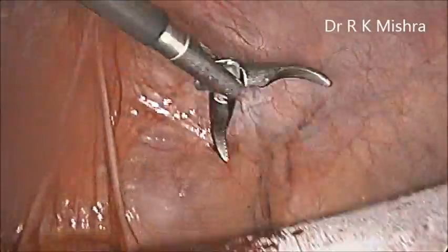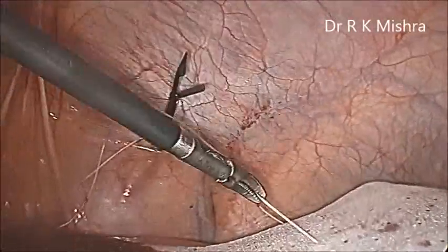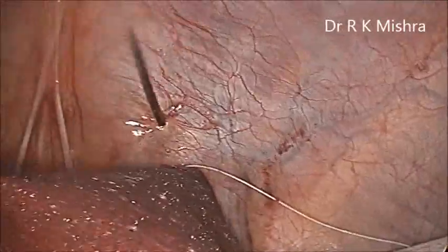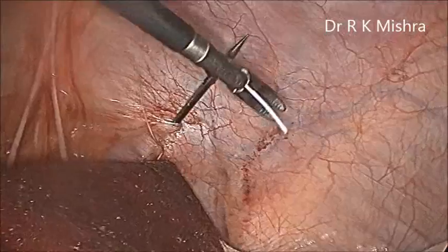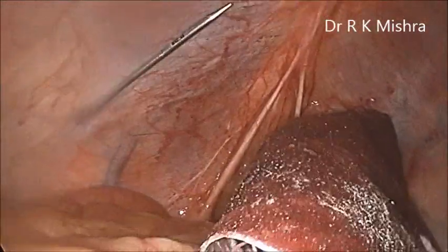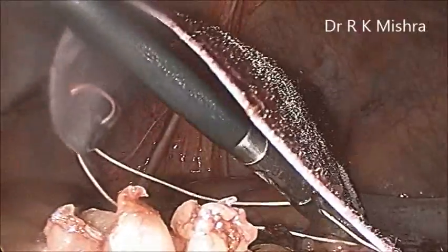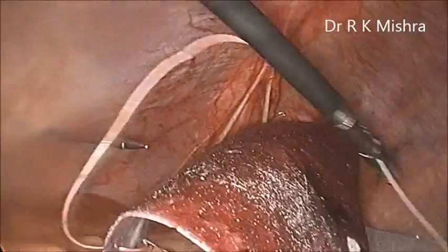Now we are using a suture passer, and every end of the thread will be pulled out one by one through different parietal muscle layers but with the same skin incision. The idea is that it will hold, but the knot will go below the skin — subcutaneous. Here you can see the inferior epigastric vessel is just lateral, so when you are pricking — especially on the lower side — the inferior epigastric vessel should be respected. One Maryland will help you to get each end of the suture one by one. Care should be taken that while pulling, both sutures should not be pulled at the same time, and the pricking should be separate.